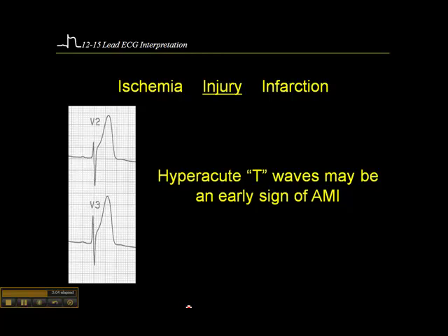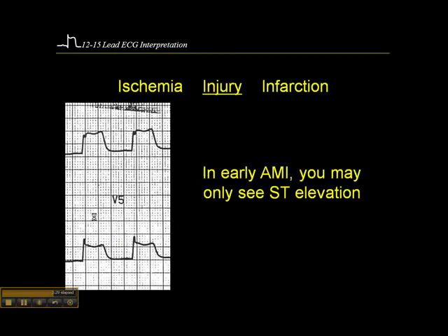In this case, we'd actually have to see them in V3 and V4 because V3 and V4 are anatomically contiguous for the anterior leads. V1 and V2 are the septal leads. In this particular case, we also happen to see ST segment elevation — here's the baseline and here's the J point roughly. So these are hyperacute T waves, but we see ST elevation with those as well. This is what you'll often see in an acute MI.